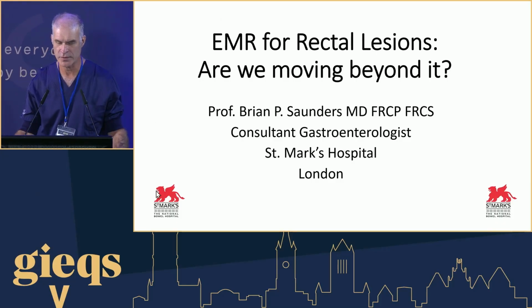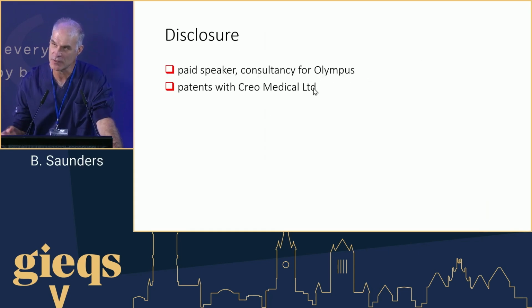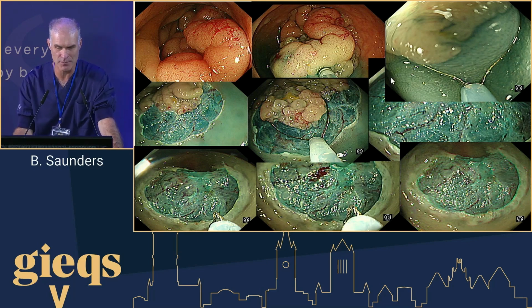Great. So, yeah, it's an interesting title. EMR for rectal lesions, are we moving beyond it? And I think this follows on from what we've seen already today. So EMR, we love EMR. It's a great technique. If it's done well, it's very good, and it's quick and relatively simple.